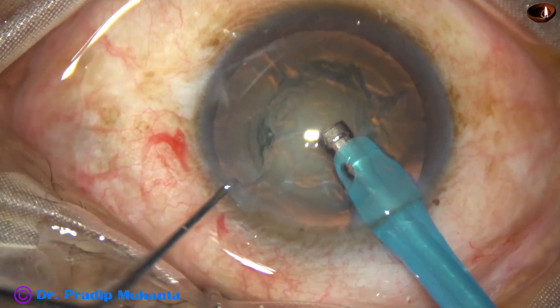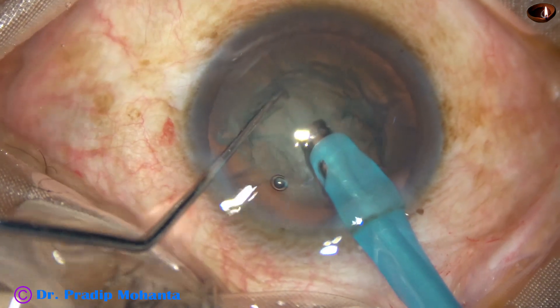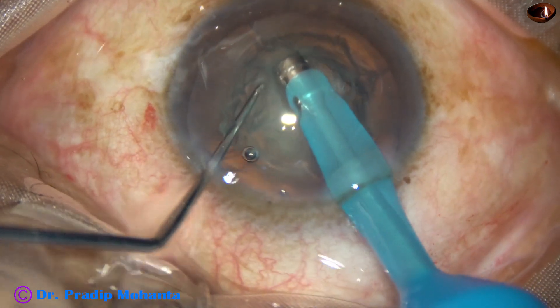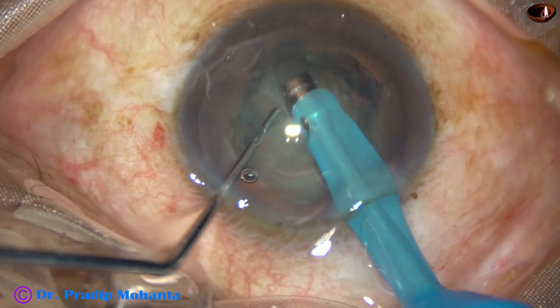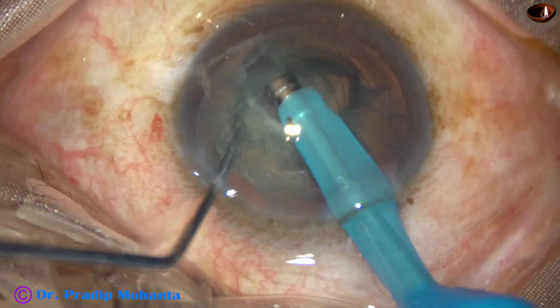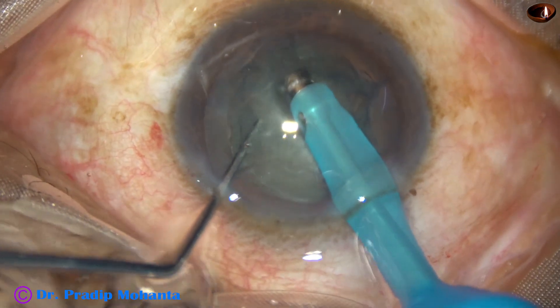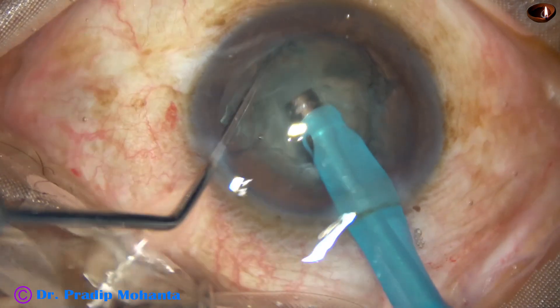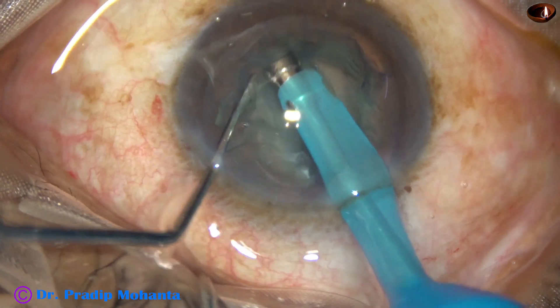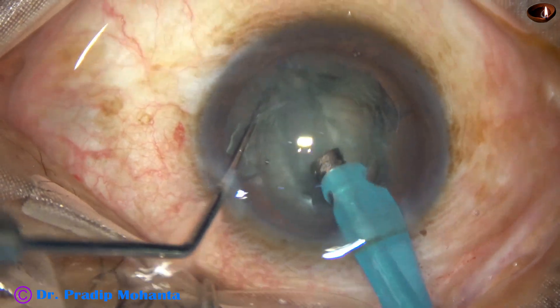Only one trench will be made. Through the center, from 11 o'clock to 5 o'clock. You must not touch the rhexis margin, and only the central part will be deepened. No need to go to extreme periphery when the cataract is so soft. Turn 180 degrees and do some more sculpting on the other side, then deepen the central part.